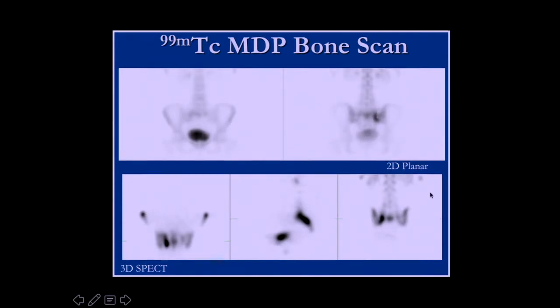And now this is a 3D view of the same area, only now this is a cross section, and I'm looking at it as if the patient's feet are coming out at you. So now, of course, the right is on my left, just to make it interesting. But anyway, this gives me much more detail, this line through the sacrum.